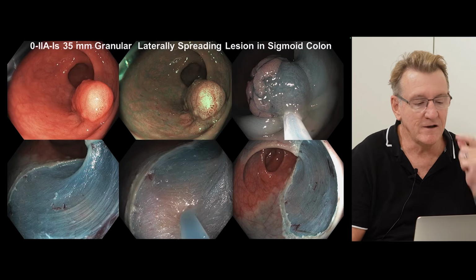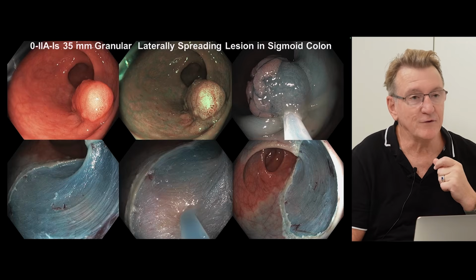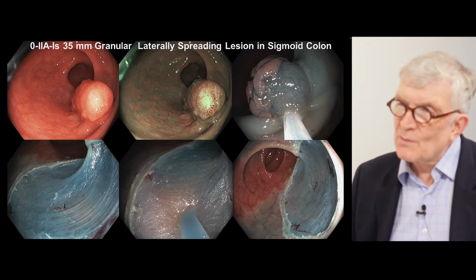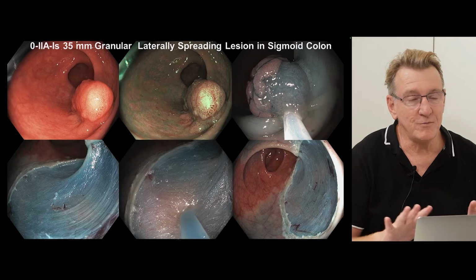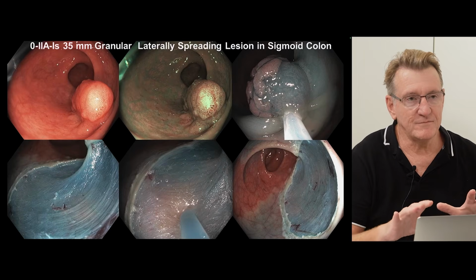There's nothing really going on, although there is a little bit of visible muscle here. Yes, that I wanted to ask. So if everything is shiny blue, it's perfect? You have to take a close look. Shiny blue intersecting fibers. It's all blue, homogeneous. Relatively homogeneous, with a few blood vessels, you're fine.